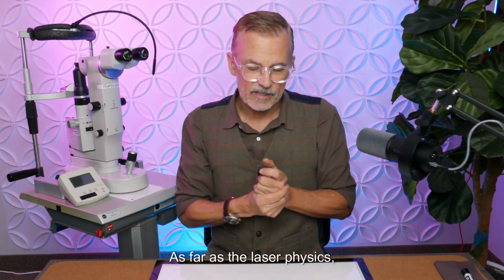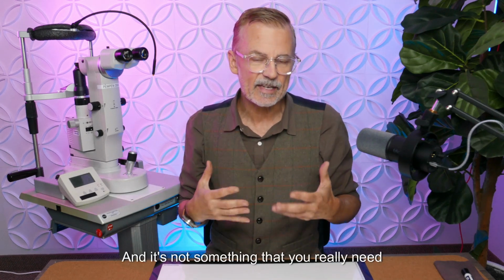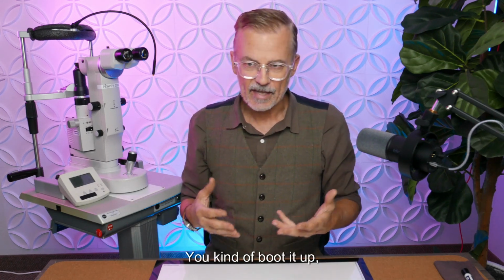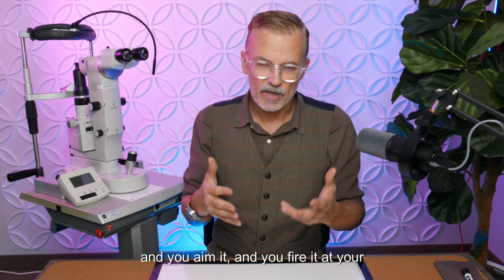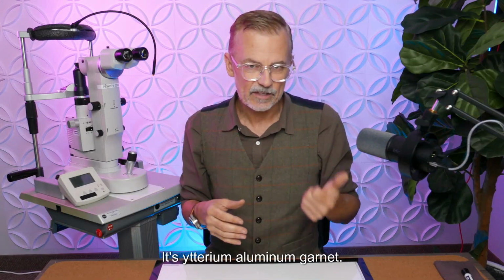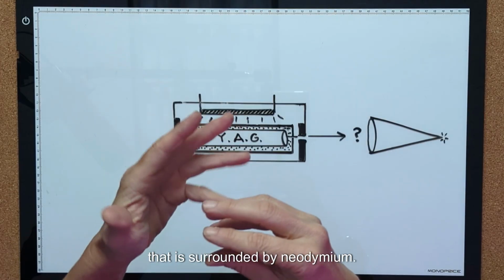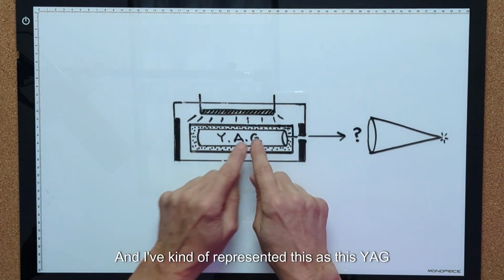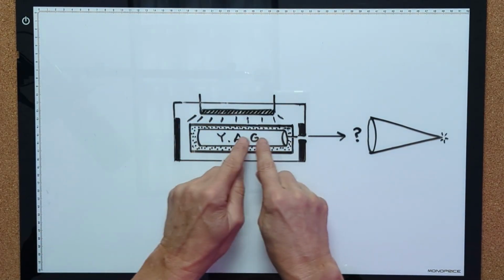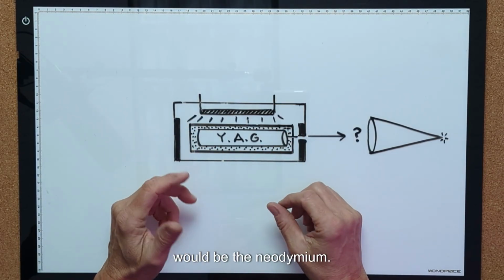As far as the laser physics, I'm no physicist, I'm no expert, and it's not something that you really need to know the details of. You kind of boot it up and you aim it and you fire at your intended target. But this is a YAG laser. It's yttrium aluminum garnet. It's a solid rod that is surrounded by neodymium, and I've kind of represented this as this YAG crystal here, and the little dots here would be the neodymium.